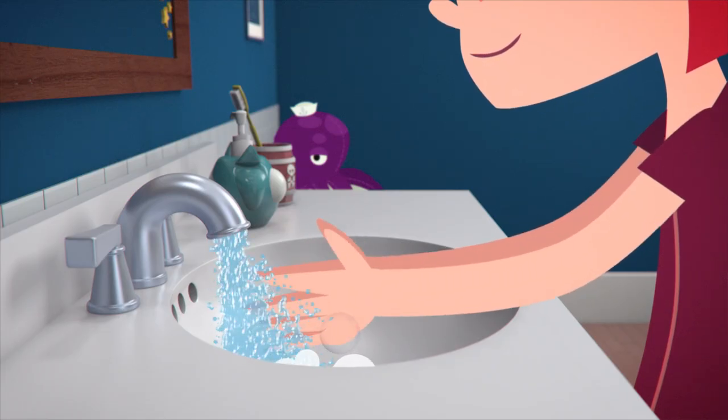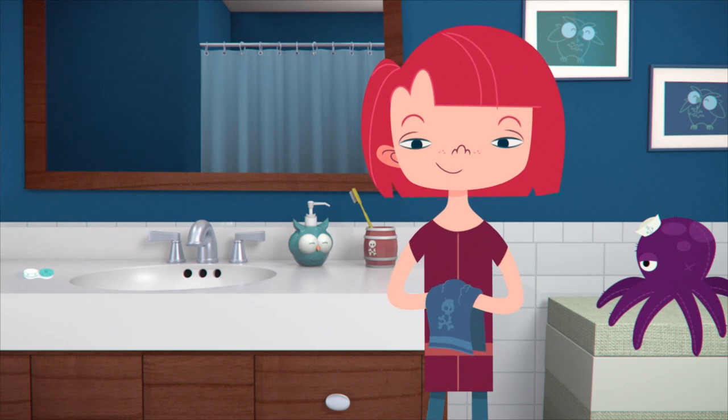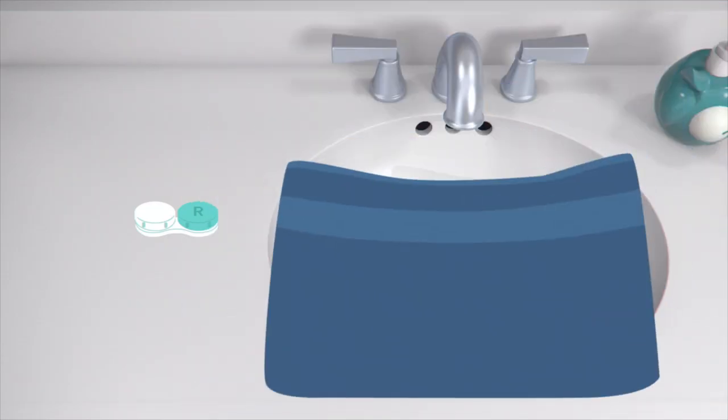As we covered in our first video on putting in your contact lenses, you'll want to begin by washing and drying your hands thoroughly, then placing a solid coloured towel over the sink so you can find your lens if you drop it.